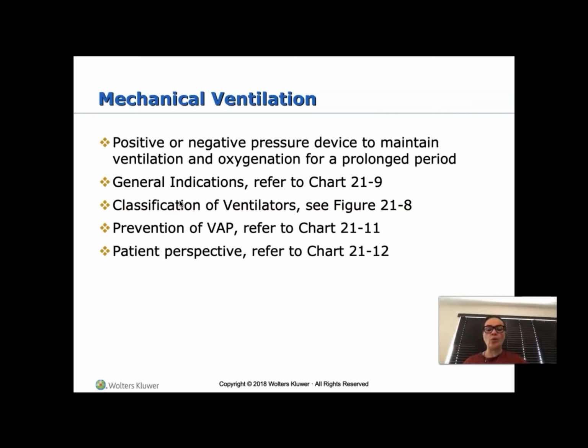So for that reason alone, the doctor will give an order with a certain amount of vent settings. We do not control the vent settings. It is a collaborative effort. The doctor says what they want, and respiratory, more than you to be very honest with you, will come set up the vent for you, get it ready with the ordered amount. But your job is to figure out, does this setting make sense for my patient? Is this what the patient needs?